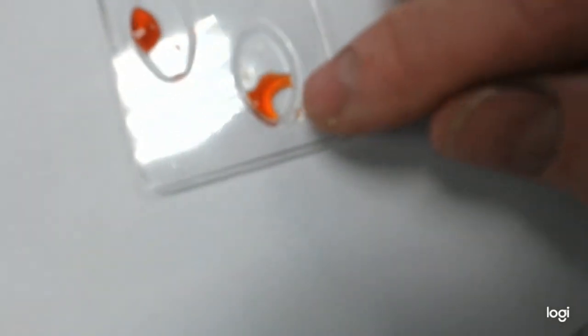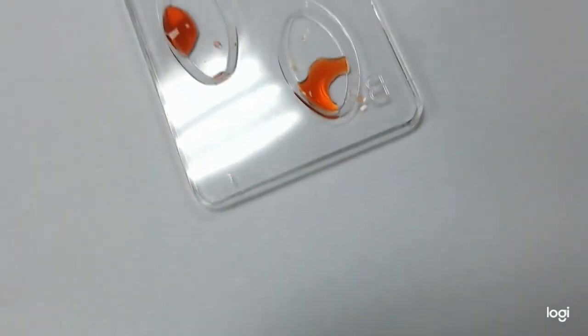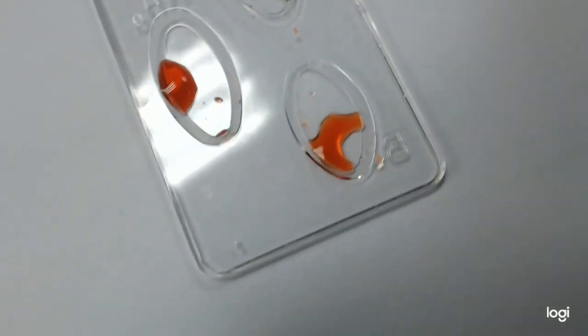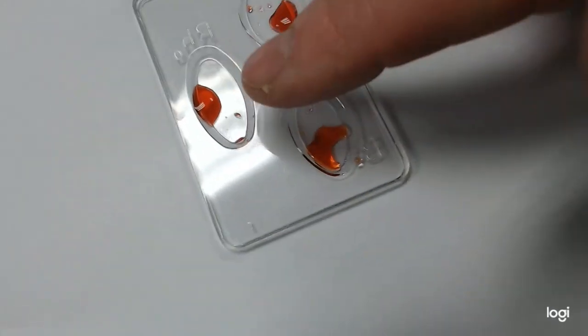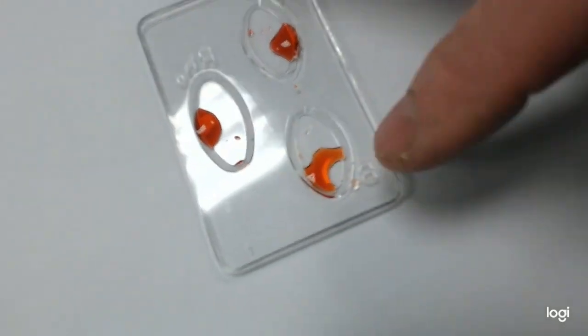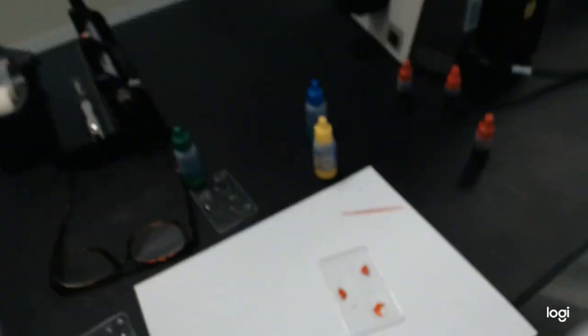If we're saying that this one's changing, you can see it's a little orange compared to the other ones. Again, if it were real blood, it would have nice little dots, speckles all through it. Maybe the next sample will do that. In that case, it would be B negative. Type B, but no RH, would be B negative. If you got B and the RH, then it would be B positive.